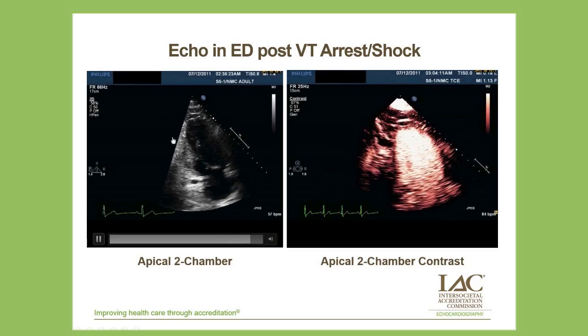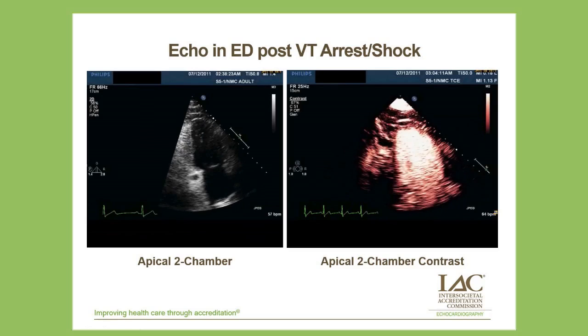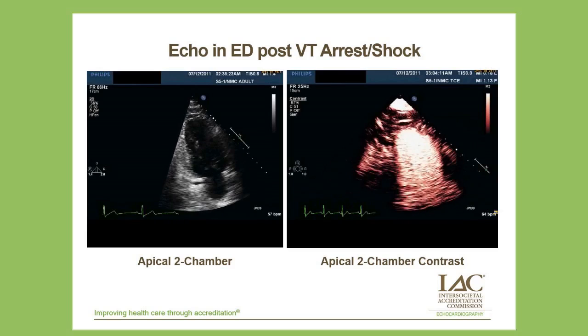The thing that's unique about this is that these regional wall motion abnormalities are in the basal segments, and we've seen with the very low mechanical index imaging technique that they are truly detectable. I think you can see it was difficult to see the inferior segments here, but in this plane right here, this inferior wall motion abnormality came in very well.